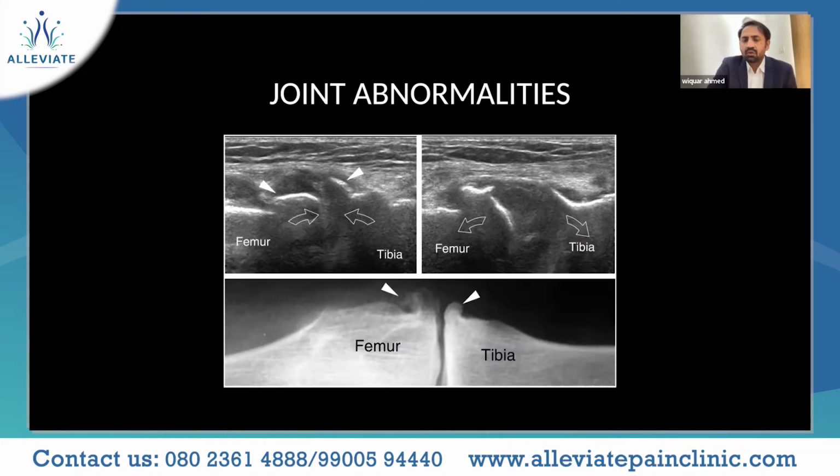But one thing we need to also remember before getting in deep is the probe position. In long axis, always the heel toeing, and the toggling in the short axis, is important for us to eliminate something called anisotropy, which is a very important aspect, wherein there are terms like hypoechoic, anechoic, and hyperechoic.